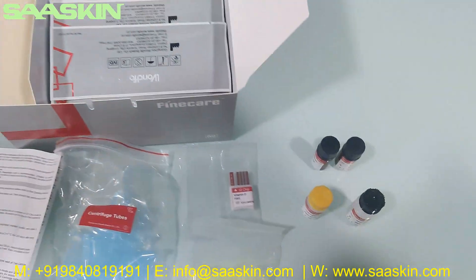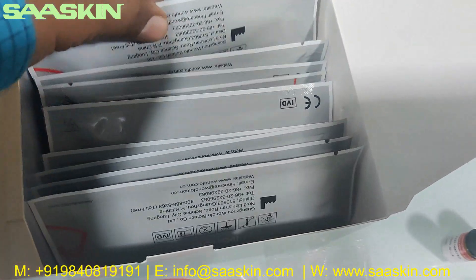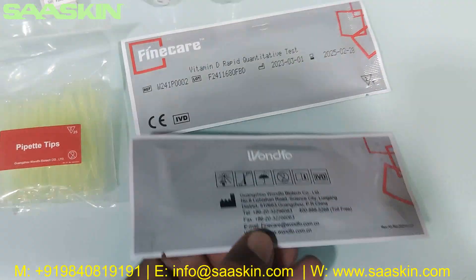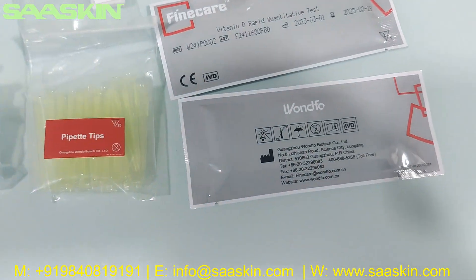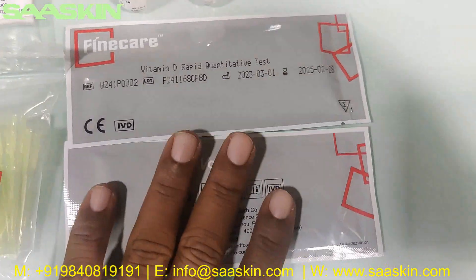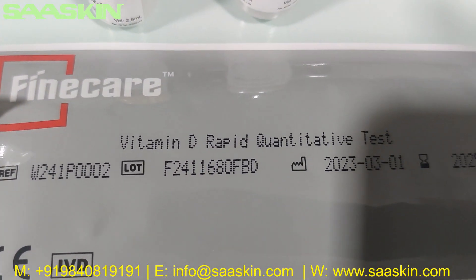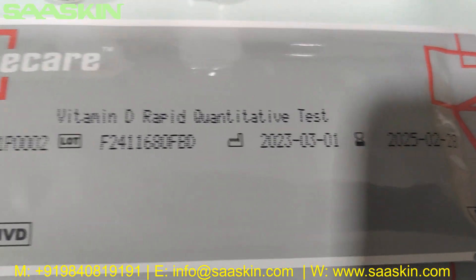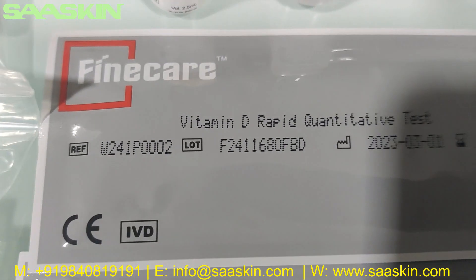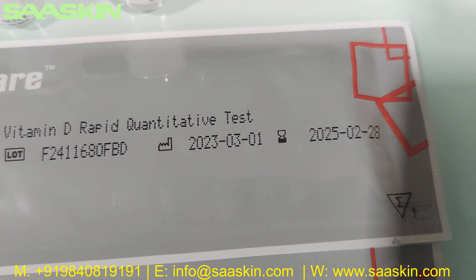And you have 25 cartridges here — I can show you two cartridges. You can see it says Fine Care Vitamin D Rapid Quantitative Test on the cartridges. In the 25 test kit box, you can see the reference part number, lot number, manufacturing and expiry date.